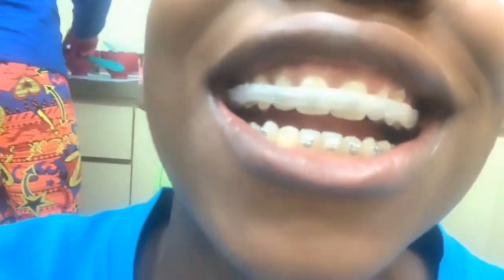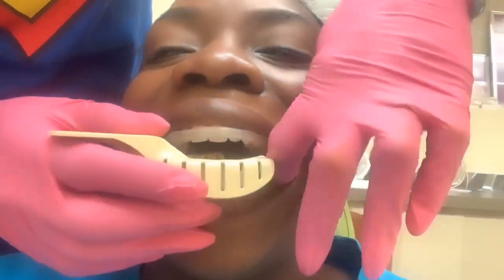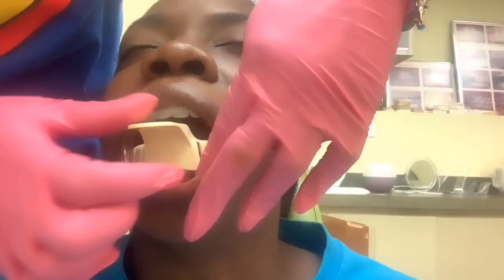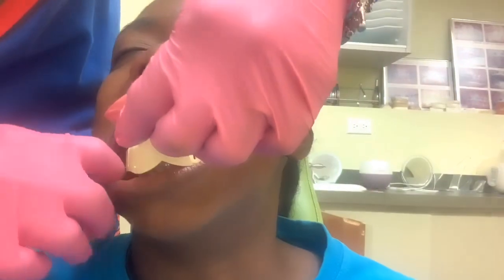So the first thing she did was take out my wires, and she also removed my tongue screen before she did the impression. Then she went ahead and put this wax over the brackets, and she put this thing, oh my gosh, I hate this thing. She put this thing in my mouth. I think it's called a tray. She put it in my mouth to see if it will fit.